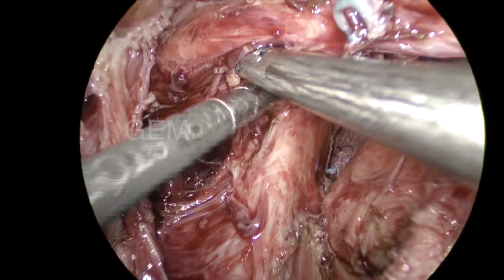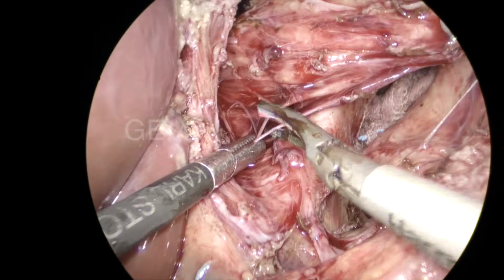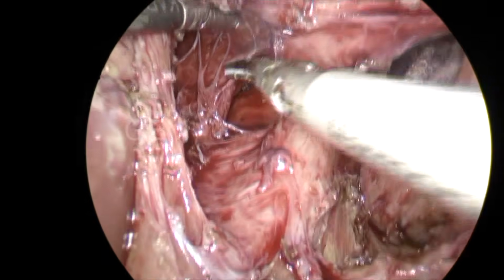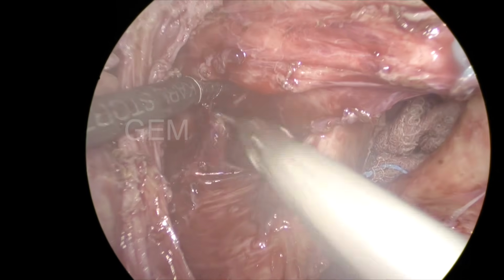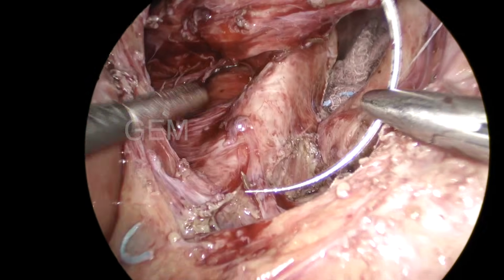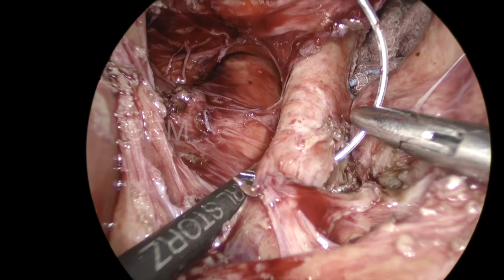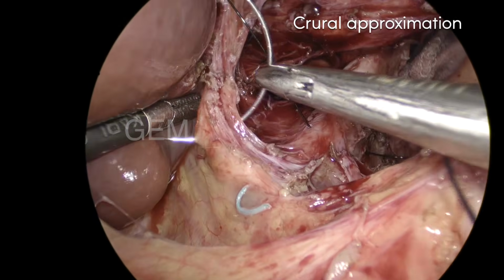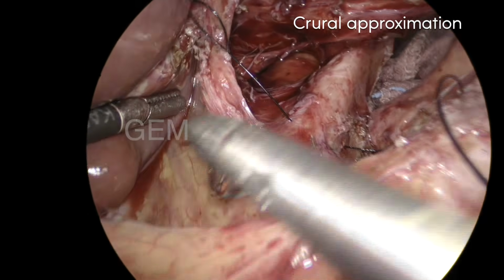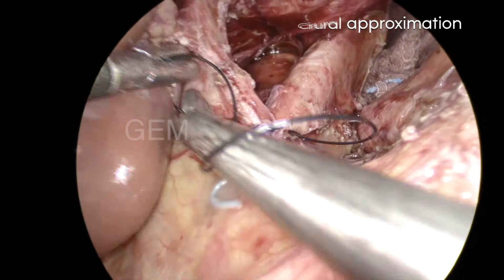So I started dissecting the lower esophagus. Usually, posterior dissection of the lower esophagus is not required in Heller's myotomy. Only the anterior dissection is required for myotomy. Posterior is no need, but here I dissected. You can see the aorta. I keep my left hand between the aorta and the left pillar of the crus. So I am taking the right pillar of the crus, and both the left pillar and right pillar are being approximated.